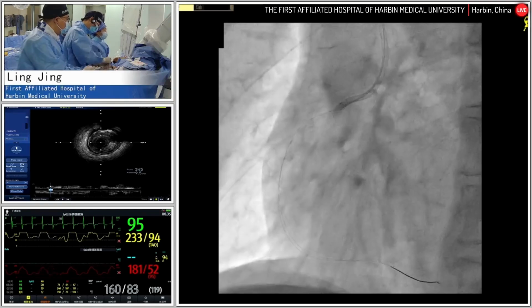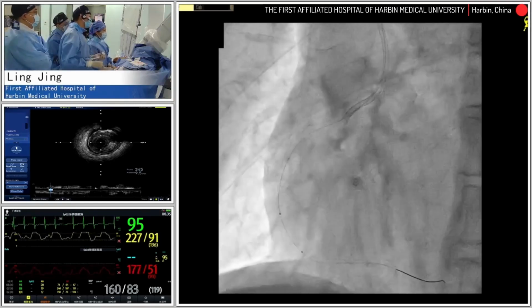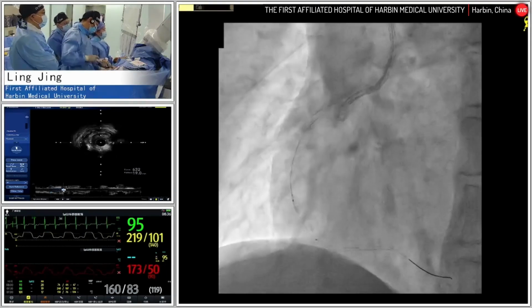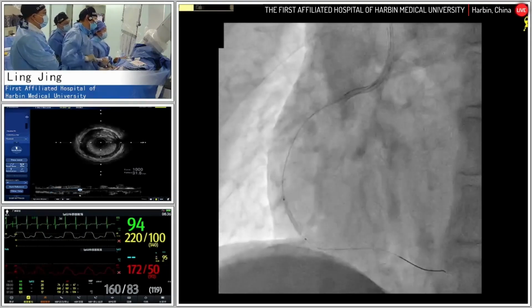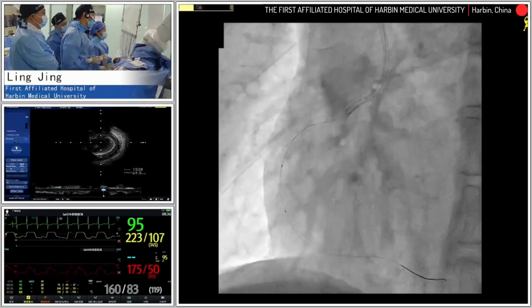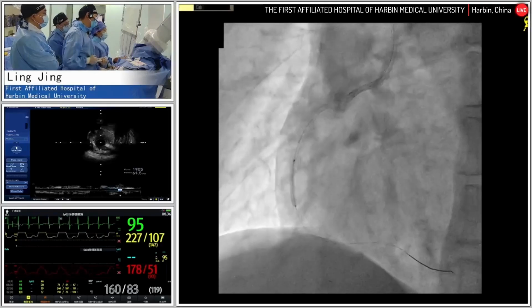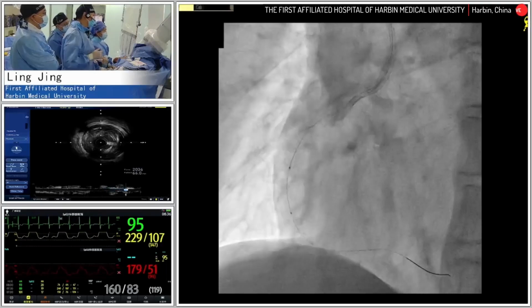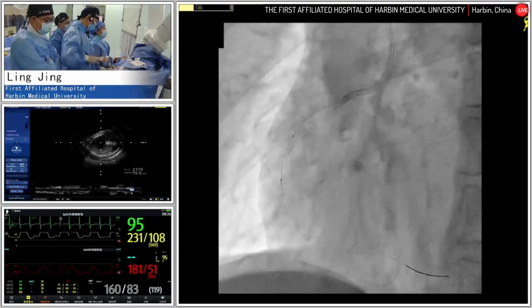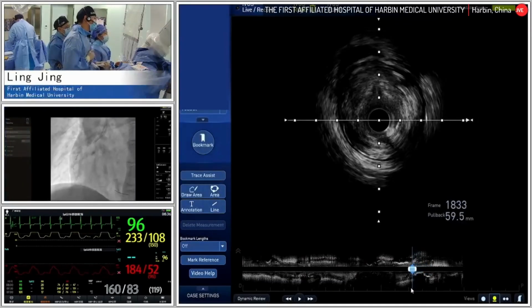We noticed some potential intimal dissection, maybe due to the dilation, so we try not to perform antegrade angio anymore. It seems the balloon opens very well. There is some superficial calcification, but not so severe. Maybe higher pressure is fine because the proximal part is okay. There is no negative remodeling. Okay, done.